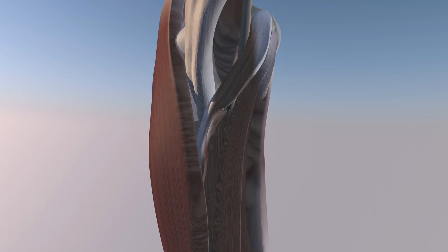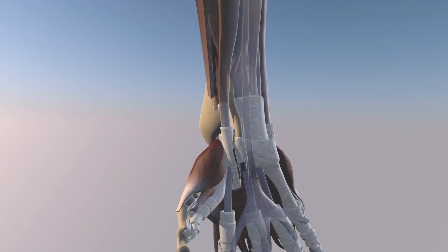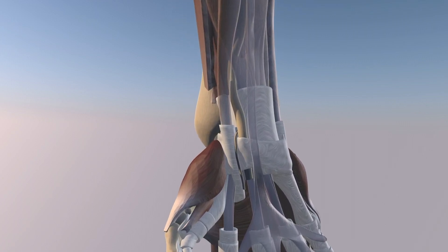Now we're making the pronator teres muscle visible again and we're going distally. Now we're making some of the flexor muscles translucent, and now we're going to focus on the wrist.